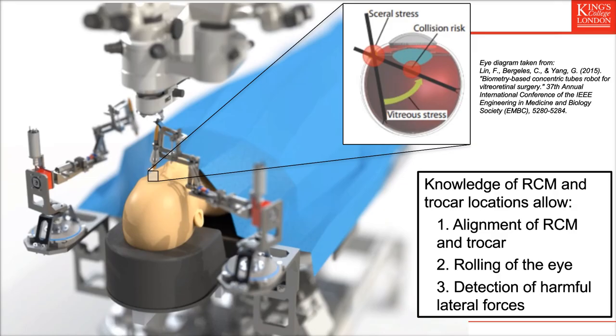Firstly, let me explain what vitreoretinal surgery is. This kind of surgery consists of the procedures where the surgeon has to treat problems at the back of the eye, including the retina, the macula, and the vitreous fluid. So you can picture this a bit better, there's a diagram on the slide of how the surgery looks inside the eye.